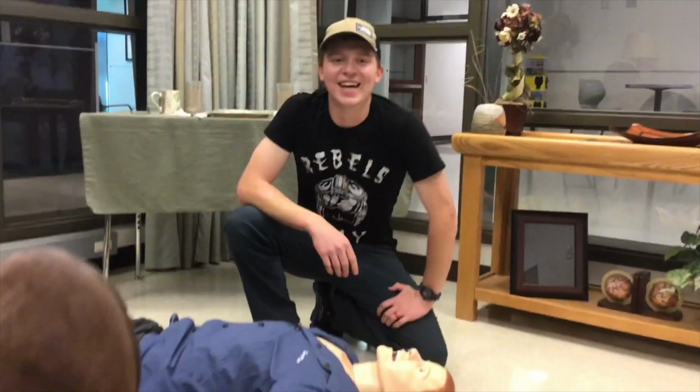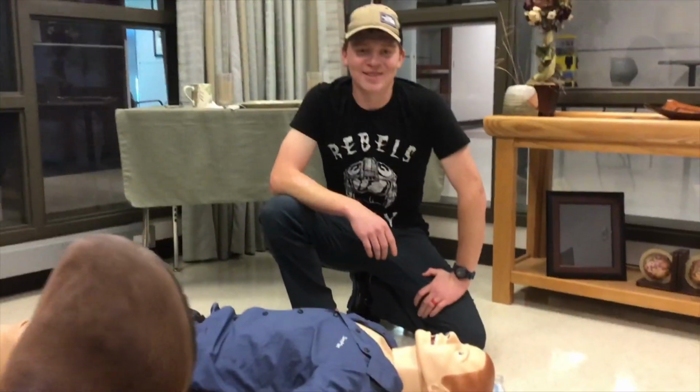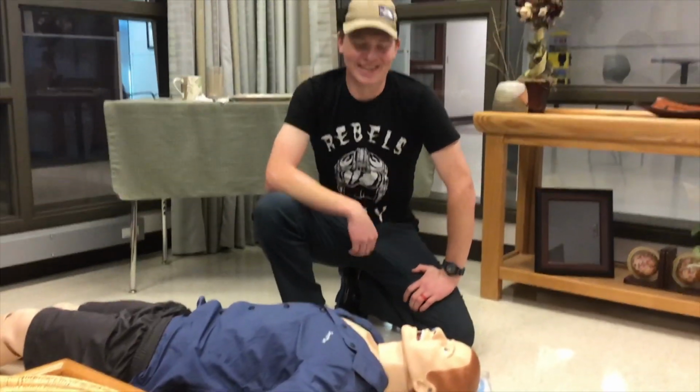All right, just like that, that completes putting in the nasal pharyngeal airway on a live mannequin. NPA contraindications, you know, facial trauma, stuff like that.